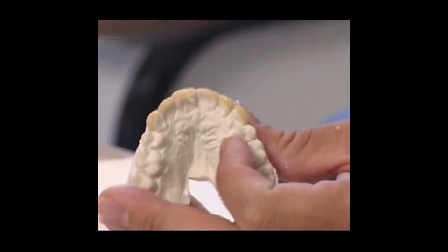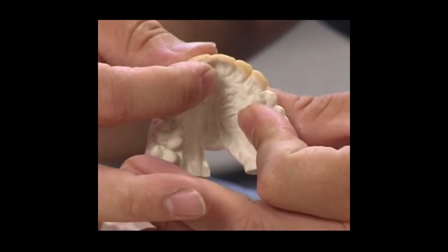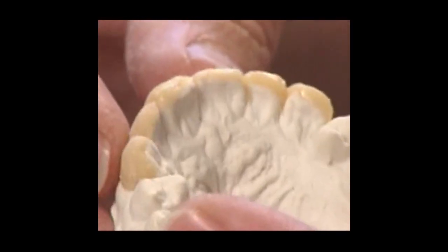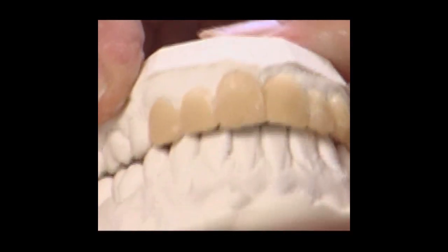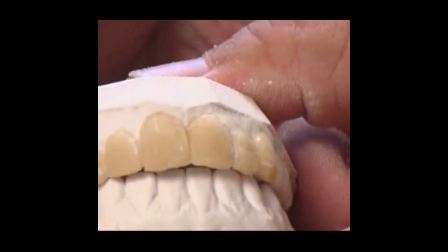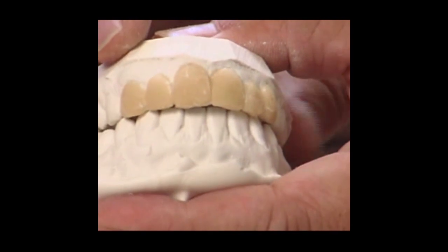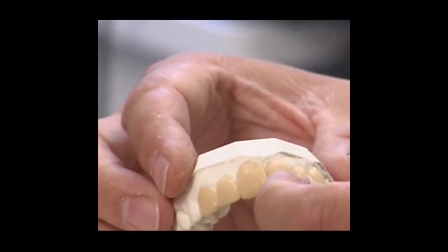Now you look at it from the lingual, you can see that it's thick, but in the patient's mouth, reducing the thickness on the lingual or labial is much easier than adding to cover those areas. So this is the way we want it to look, and this is what we're looking for. And I can put it back onto the counter model to see. You shouldn't spend more than 10 minutes or so to do this. If you spend an hour doing this, obviously you're wasting too much time. So we want to concentrate on the sizing of what we wanted to achieve.